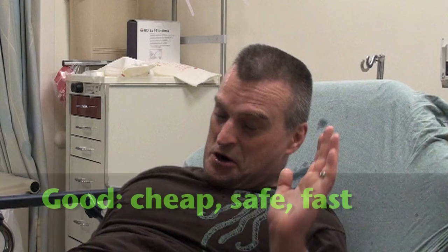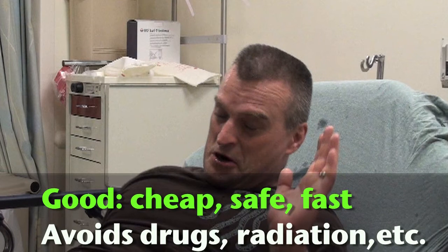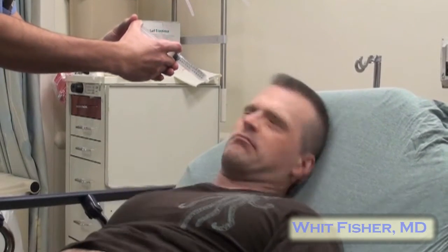The good things about this test are that it is cheap, safe, and fast, and it can spare the patient from being exposed to dangerous drugs and procedures like CAT scans or even intubation. The bad thing about this test is that it looks really mean. Do not do it with a smirk on your face, and do not laugh, especially if family members are present, because they can definitely take it the wrong way.